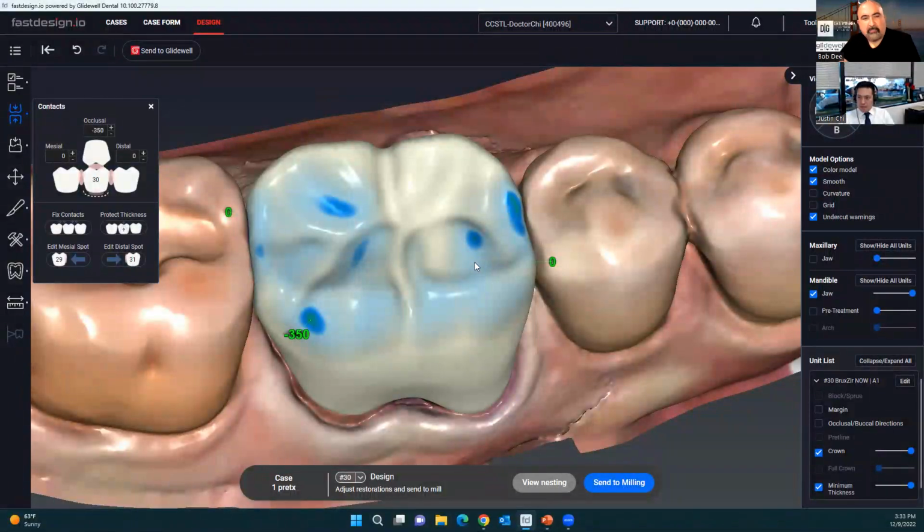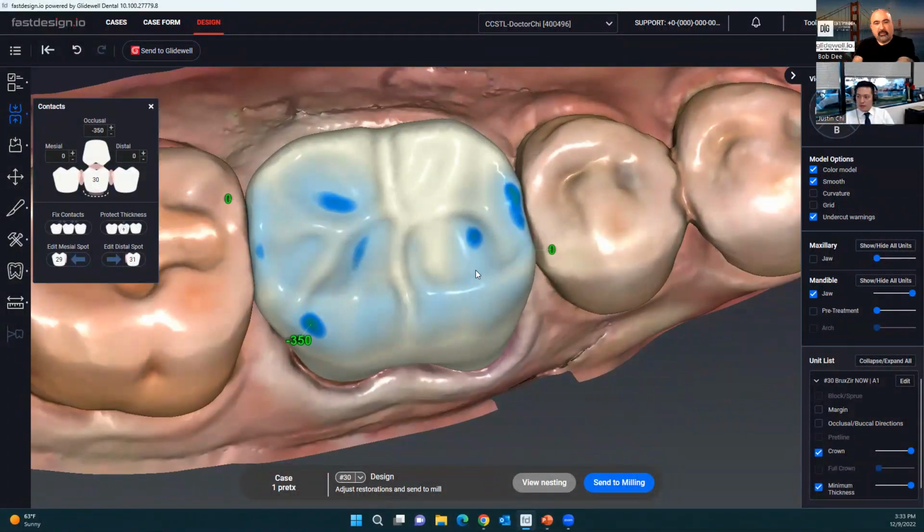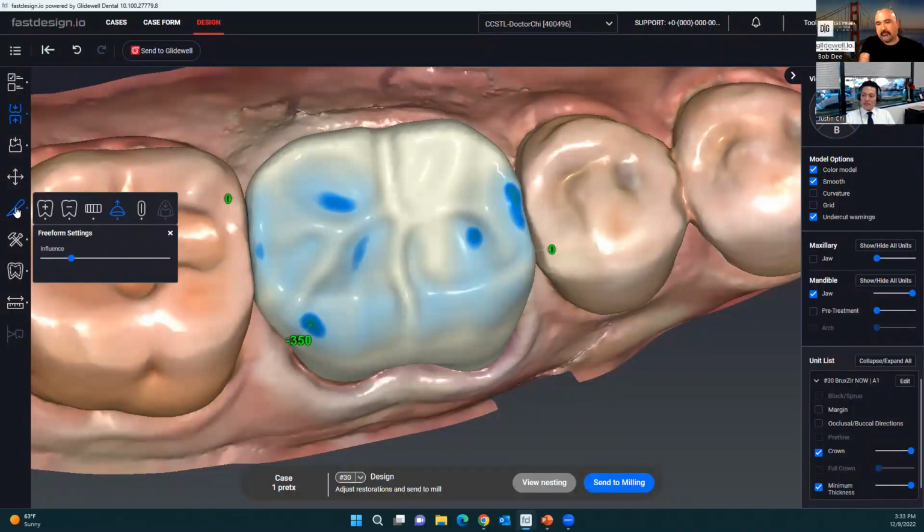Yeah, before you move away from this slide, I wanted to let people also know that there are other functions in this software. Let's say someone may feel like, oh, this crown is a little bit boxy, I want to round this corner off. There are a lot of little icons on the left-hand side that are really easy to learn, and it's not that difficult. You'll get it: smoothing, moving, adding. Like I talked about those last teeth in the mouth that may move distally, you can adjust the contacts yourself. Within a month, you'll learn all of those.